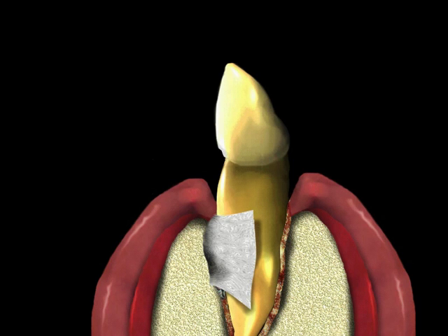The membrane typically is kept in place from 4 to 6 weeks, then either needs to be removed or is absorbed by your body. The defect will take longer for the tissue or bone to mature, but over time, probing depths will be reduced, making the defect easier to maintain.